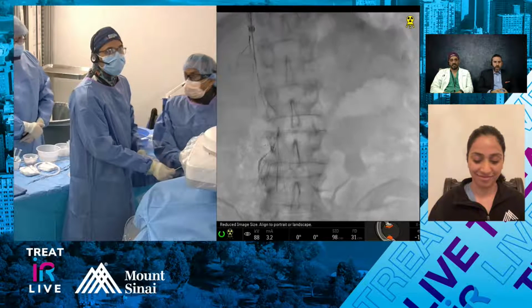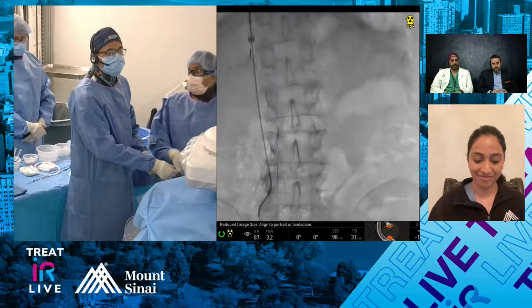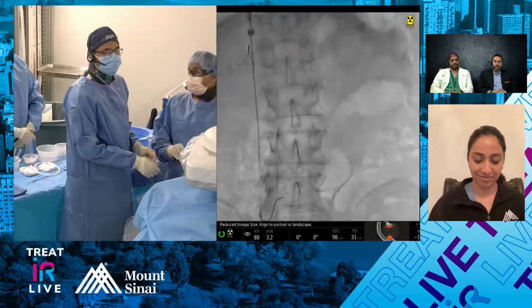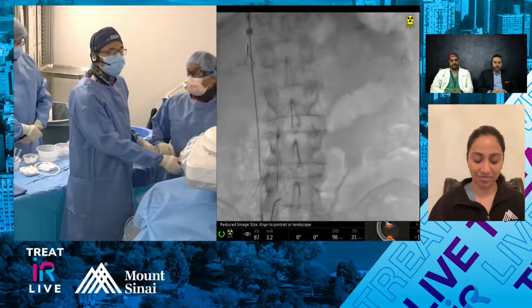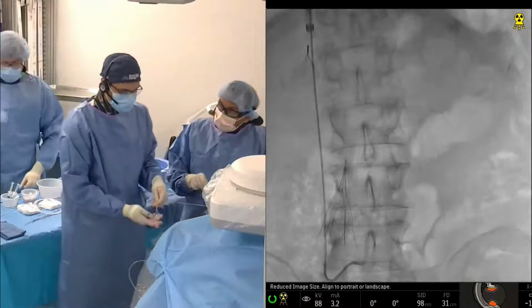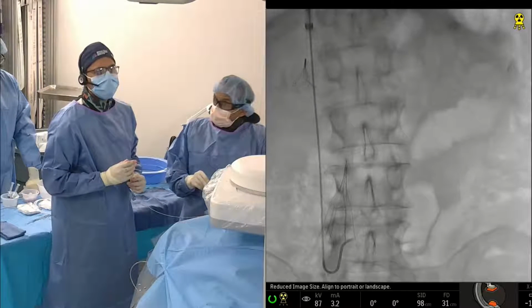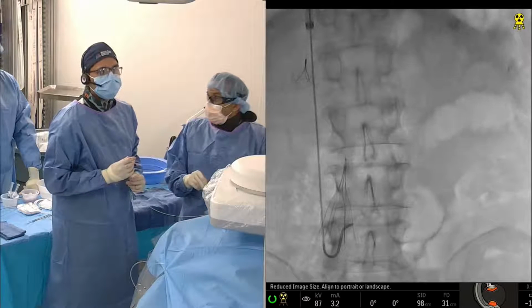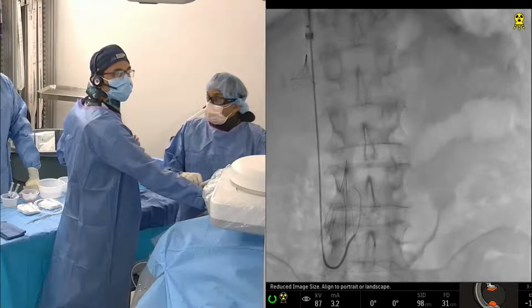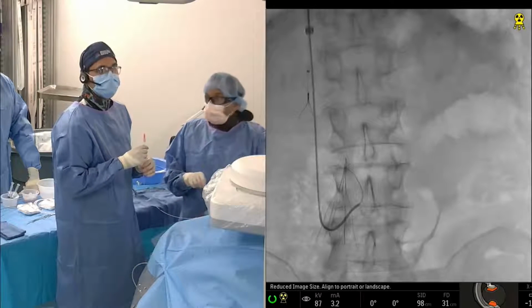Yeah, same. So Raj, just in terms of your setup for doing the hangman, it looks like you're using a reverse curve catheter. It looks like you switched to a Contra here to give you a little bit more control over the wire. I agree with all the comments about the hangman, but in particular your comment, Rahul, that sometimes even when we can successfully accomplish this hangman, you wind up pulling up on one part of the filter, one of the legs comes up, and instead of really pulling the hook cleanly off, which is obviously what we're trying to do.